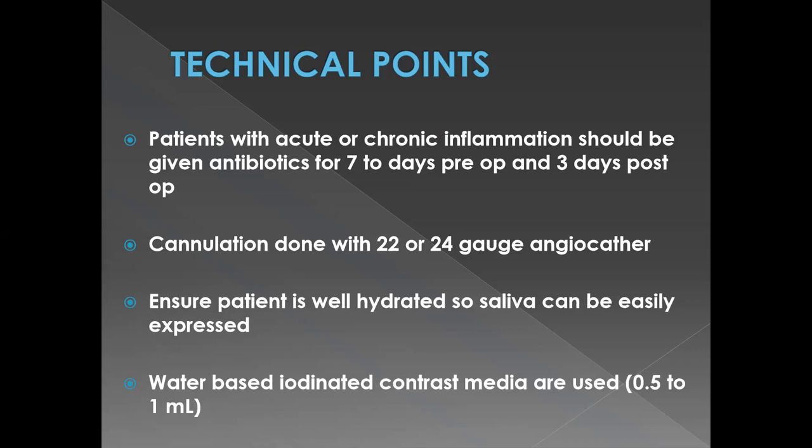However, if it is not very clear to you, then you can do a couple of things. Number one, the patient has to be quite well hydrated. If the patient is not well hydrated, then you cannot manually press the duct for expulsion of saliva. That will give you an idea where the orifice is located. So if he's dehydrated, this method will not work. So you have to keep the patient well hydrated. There's no concept of NBM in such cases. These procedures are done in an OT, but without any anesthesia as such.